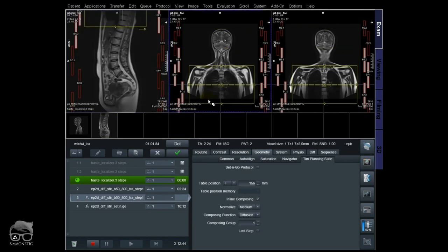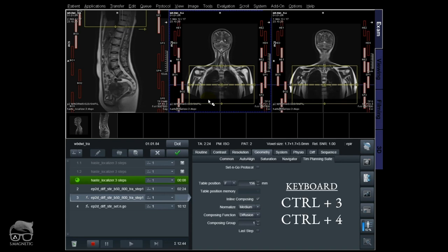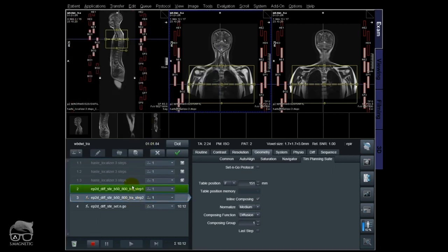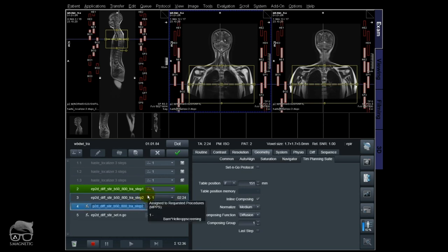What I'm using here is control three and four, then five and six — I'll show you why. I move the box within the field of view. Let's write step two — there you go. The localizer is done now and it's composed, so I get an overview. While that is done, step one is running, so no dead time in the scanner. Let's go for step three and I'll show you how to use the keyboard to move the box fast.